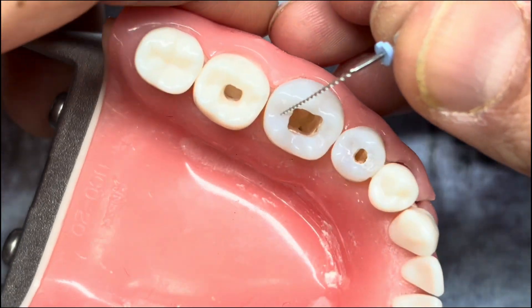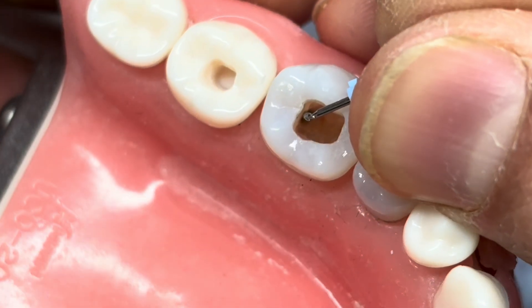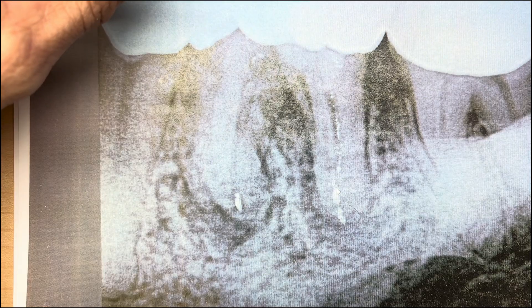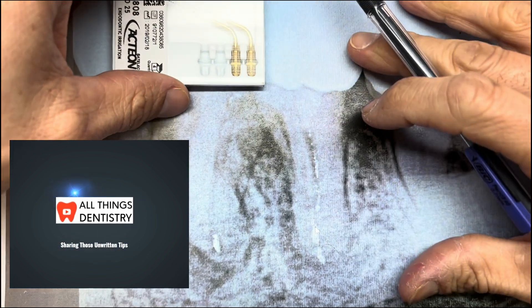The debris is a little macronal. You can use this kind of like a feeler, then place this and run the file to the side of the canal and pull up. Hey, this is Ash. All Things Dentistry, the place where we're passionate about sharing those unwritten hints and tips of dentistry.